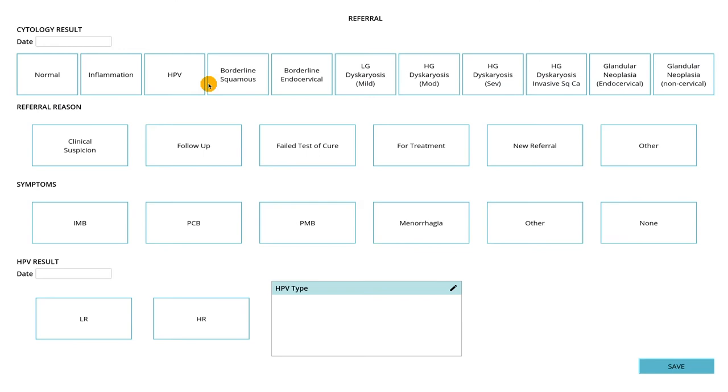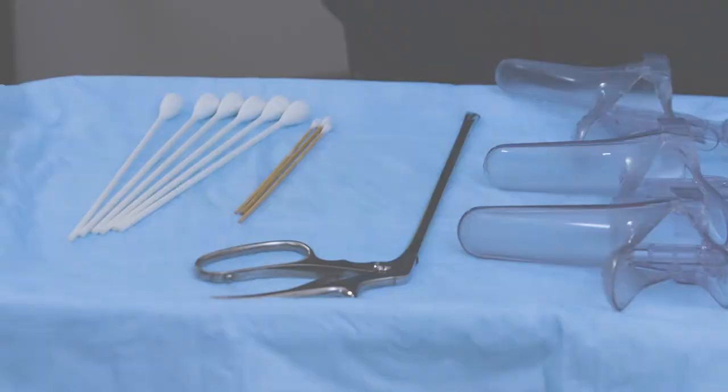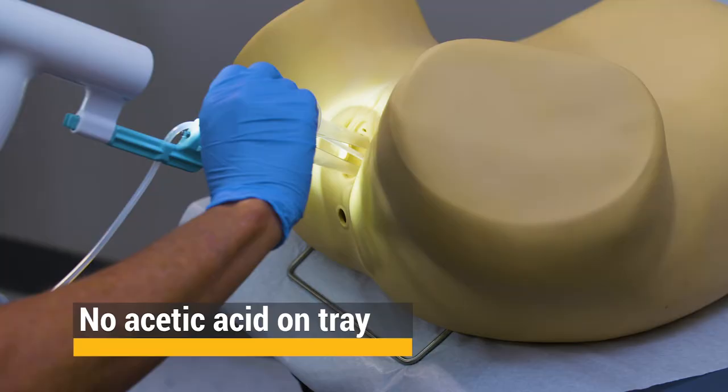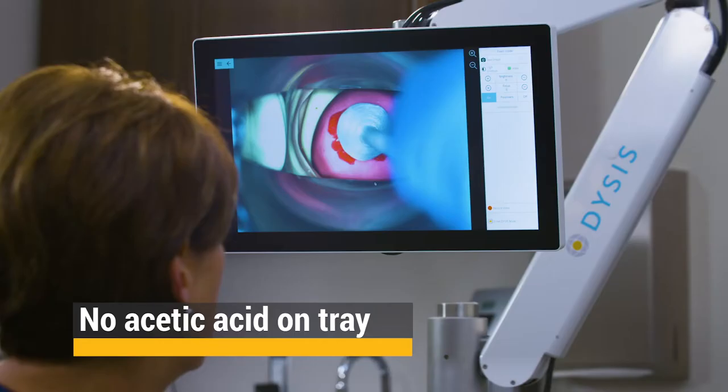Procedure Tray Setup. The procedure tray is set up as usual for a colposcopy exam, except there should be no acetic acid on the tray. The provider should clean the cervix with a dry swab or saline prior to the Dysys exam.